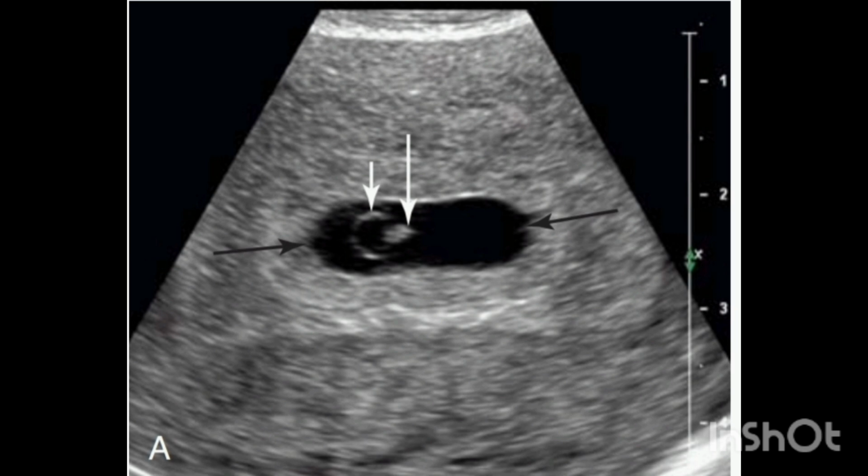Together, these three key structures, the gestational sac, yolk sac, and early embryo, provide essential information for early pregnancy dating and determining pregnancy viability. Abnormalities in these structures, such as the absence of yolk sac or embryo at the appropriate gestational age, may warrant further clinical investigation.